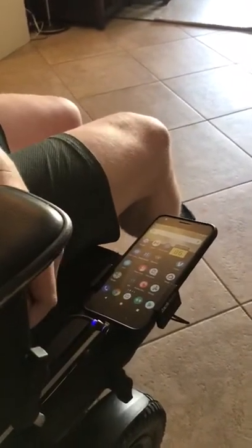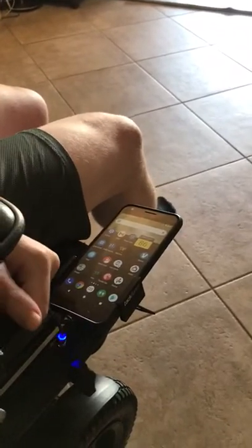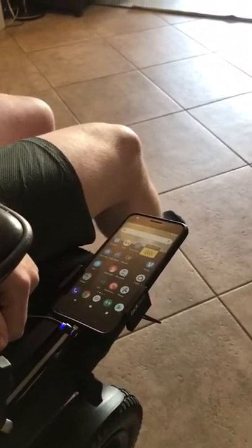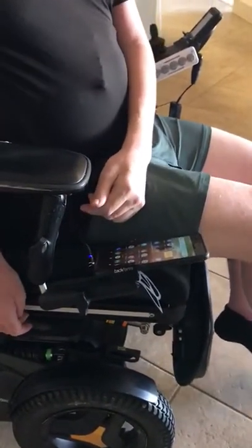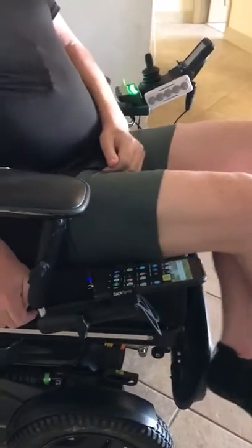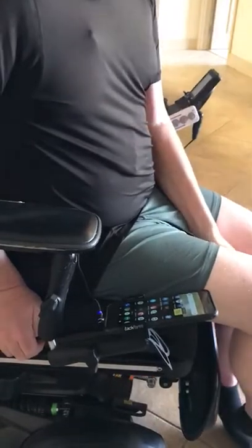The cable is magnetic, so I can unplug it and plug it back in really easily. My phone is connected to the wheelchair using a RAM mount system. They're pretty cheap — I think you can get the whole thing for about 80 bucks on Amazon.